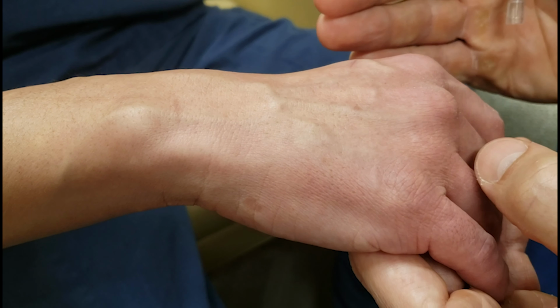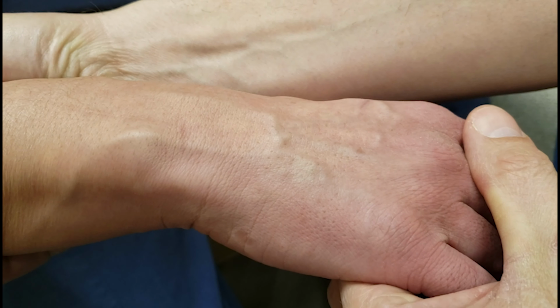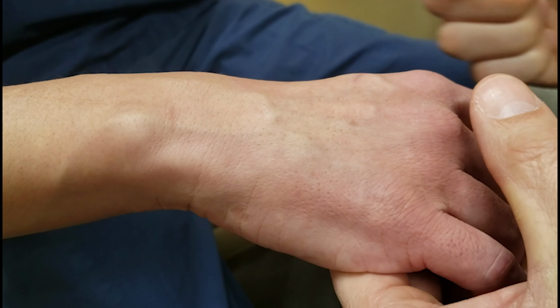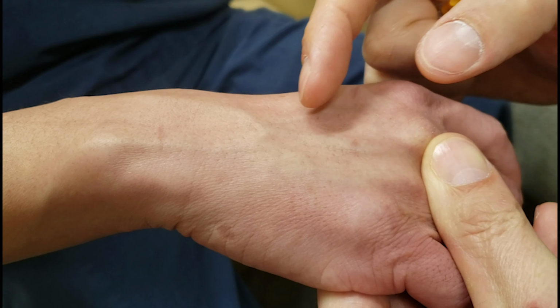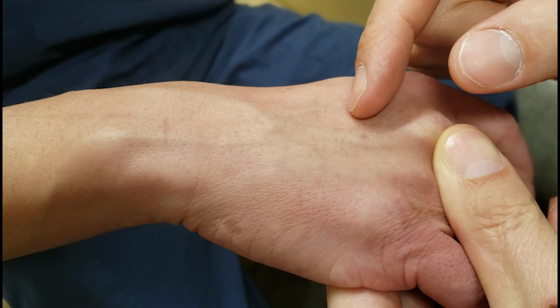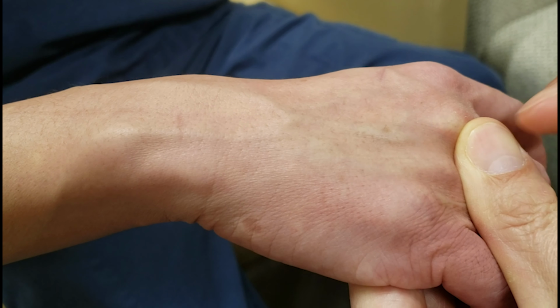What's one way that I could minimize all those factors? First, I'm going to put a tourniquet on. When I put a tourniquet on, it puts back pressure on these veins and they blow up, as you can see here. The next thing I do is take my thumb and pull down gently on the vein. What does that do? That straightens the vein, takes all that tortuosity out, and also takes the slack out of the vein, so it's more tethered.